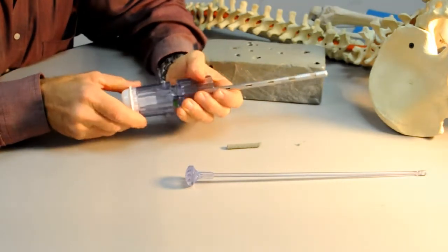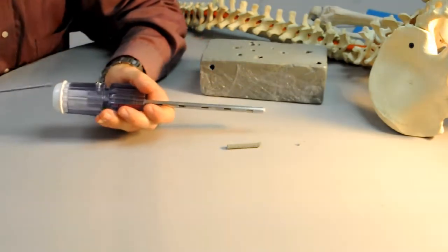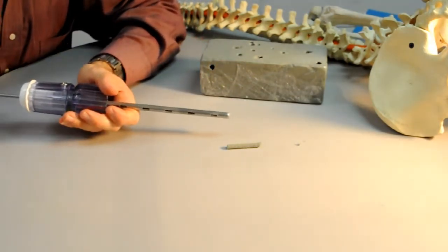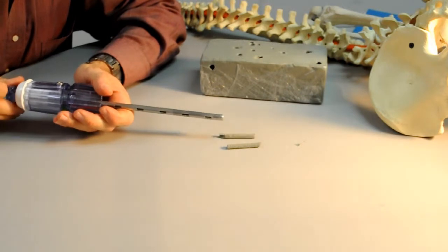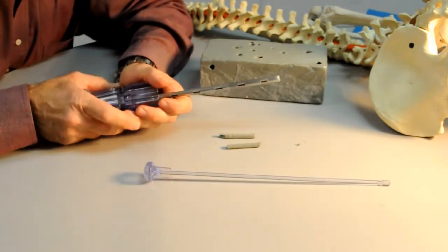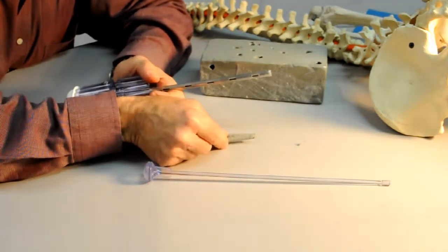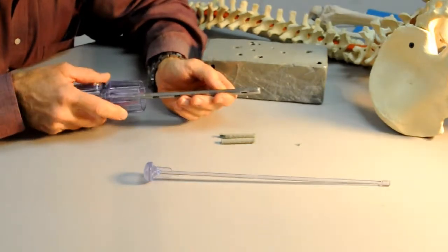We again rotate to the fully open position, rotating counterclockwise, and lock it in the open position. We are now ready to insert our plunger and deliver the cancellous bone. This can be repeated at the site in various directions producing cylindrical cancellous bone of approximately five centimeters length.